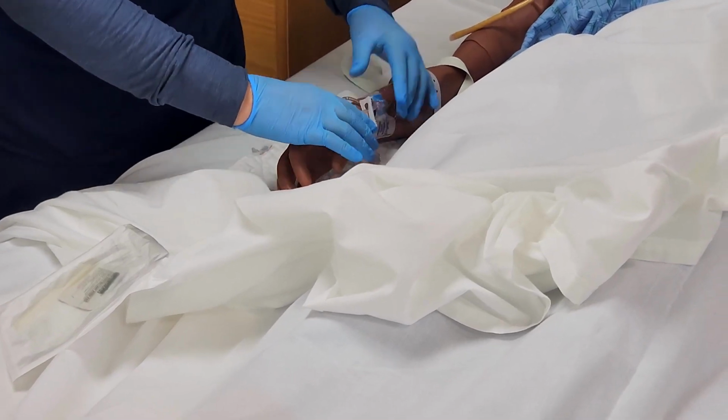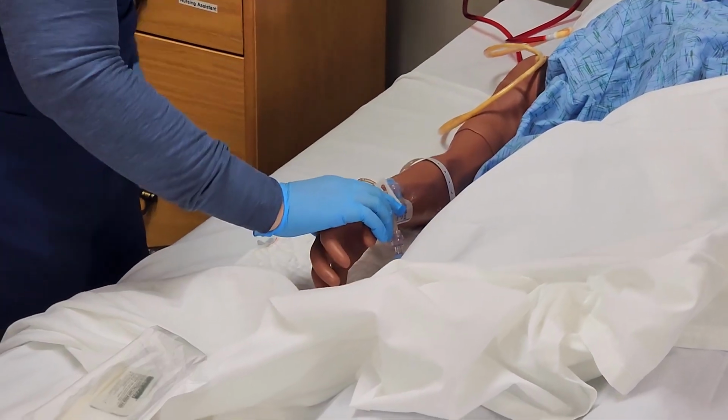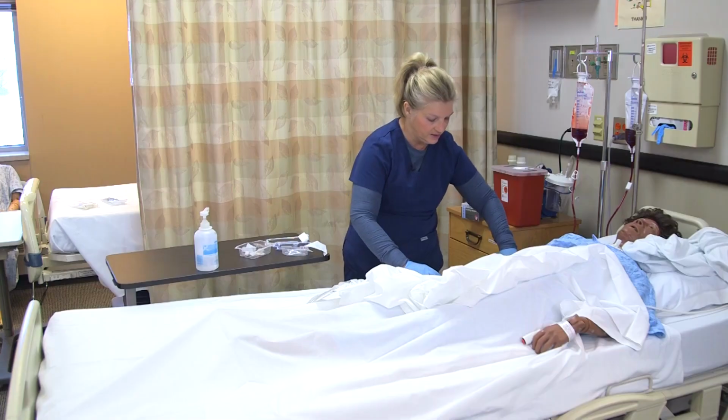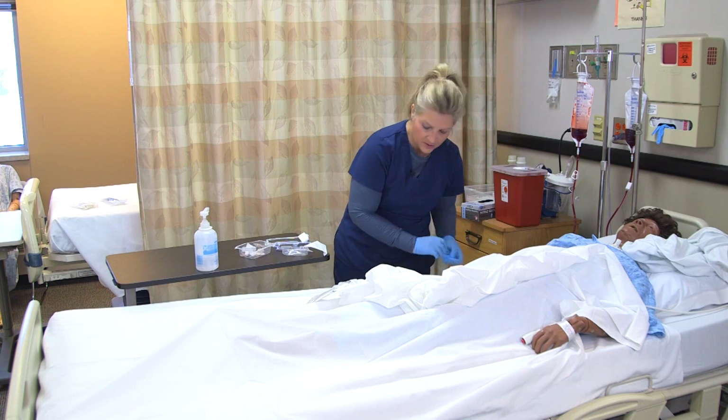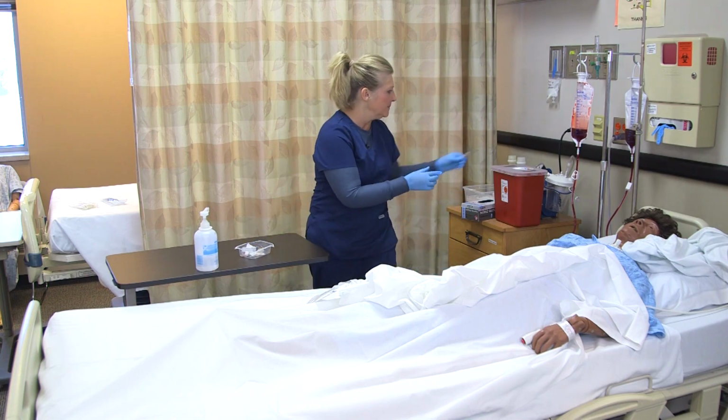Okay, and it remains clamped. And then I ask the patient how they're doing. The patient states they're doing okay. And then I make sure that all my supplies are discarded and my sharps are in the sharps container.